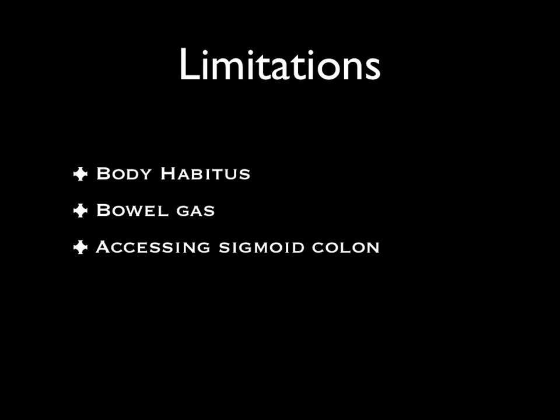It's important to recognize that this exam is not without limitations. Views may be limited in obese patients. Although the scan was performed with the low-frequency curvilinear probe, it's actually best to obtain higher resolution images using a linear probe if possible. In reality, this may not be feasible in our larger patients.